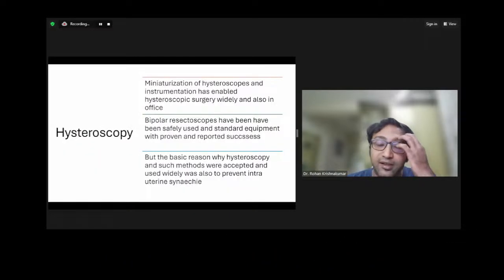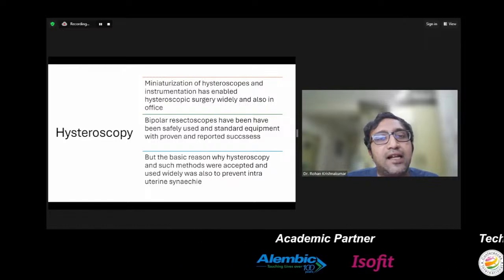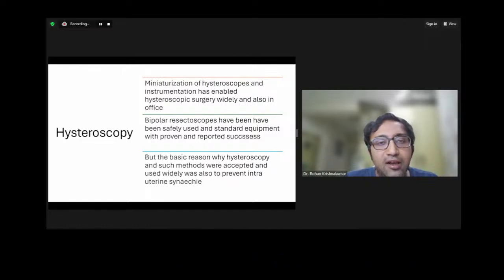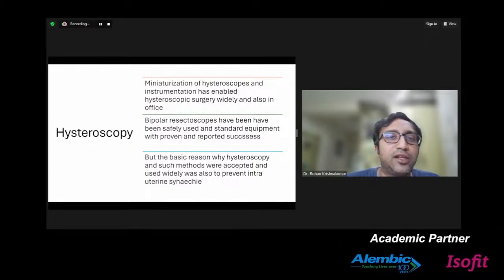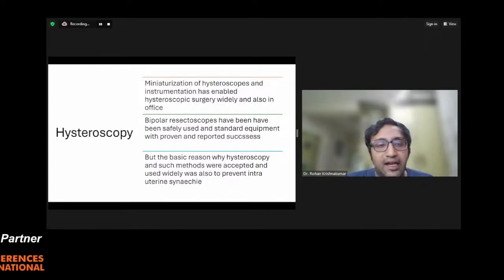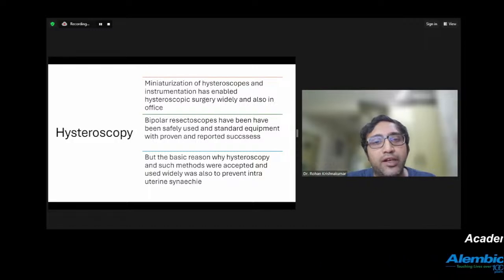Further, my next area is on newer hysteroscopes and newer technologies. In that, we saw a brilliant talk by Amok where he described scissors and resectoscopy for RPOC. Unfortunately, for the sake of time, I thought I shouldn't include the RPOC videos, so I've not included them. We all know hysteroscopy.